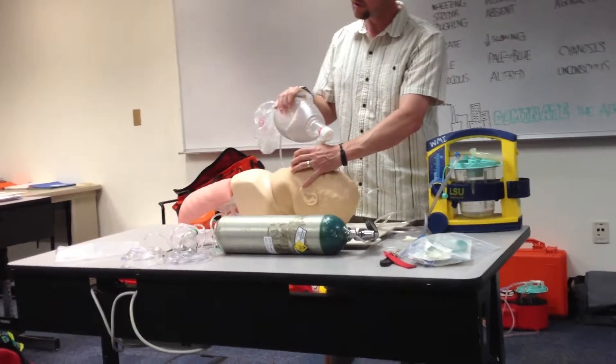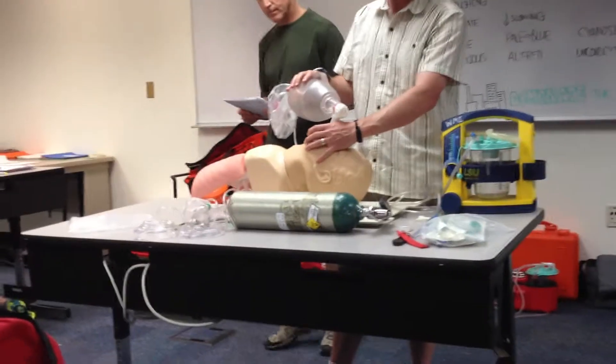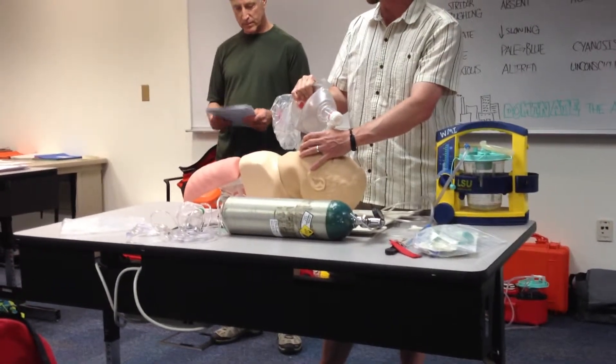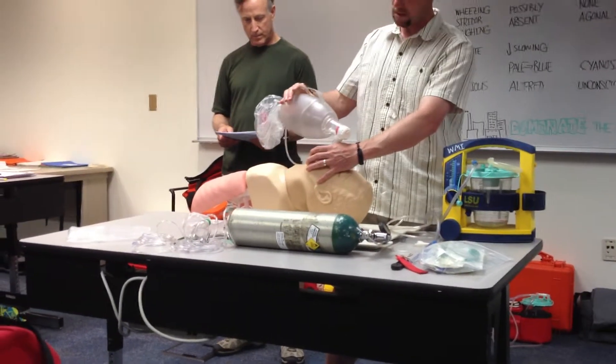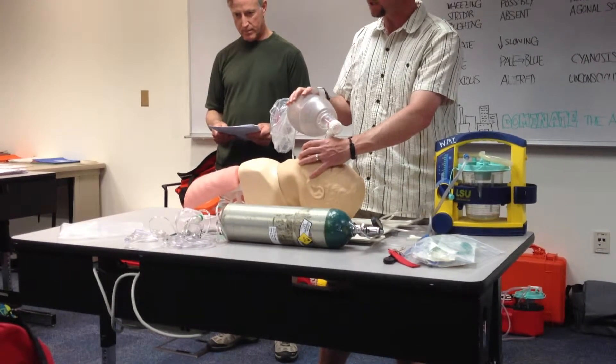I've got a good seal. The mask is the right size for my patient's face. I'm going to breathe about one breath every six seconds, just enough to get that chest rise. The volume of roughly half of the bag — I know that this bag is about a liter, and I really only need about 500 milliliters in my patient's chest.